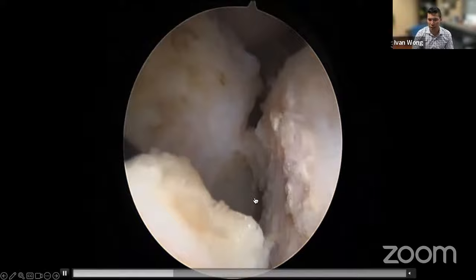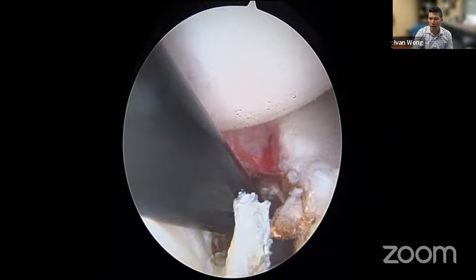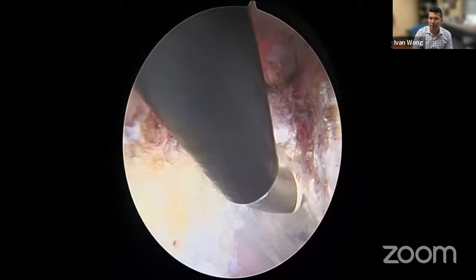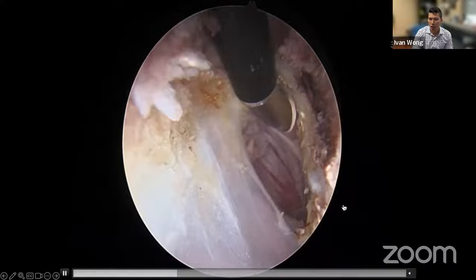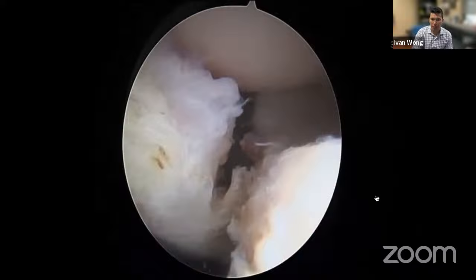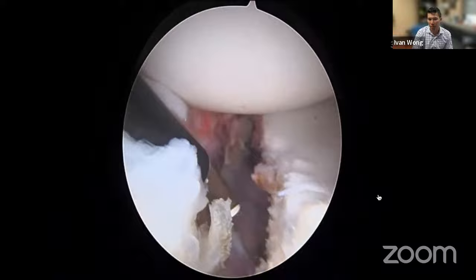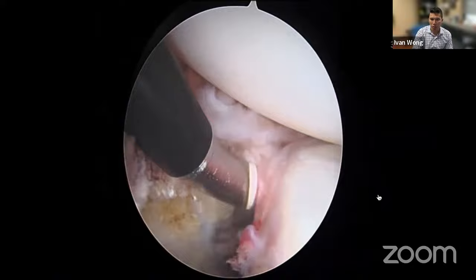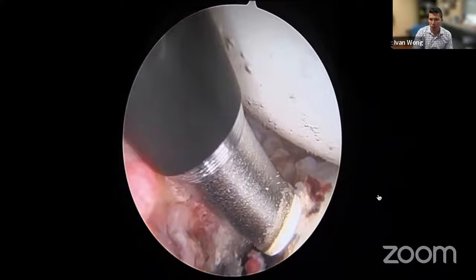Using the cautery probe facing the bone — not the labrum or capsule tissue — we elevate the periosteum off by using the edges of the probe, preserving all tissue. This cautery approach prevents the bleeding that a Bankart knife causes, making visualization much easier. We get more tissue this way because we're taking the periosteum with us. The labrum is starting to 'float' back to the level of the glenoid — all the tissue reduced back to the right level.